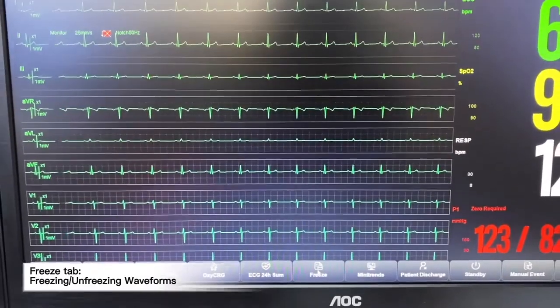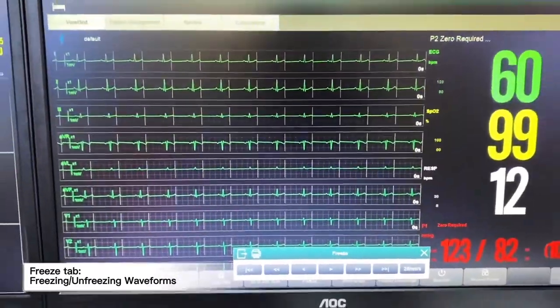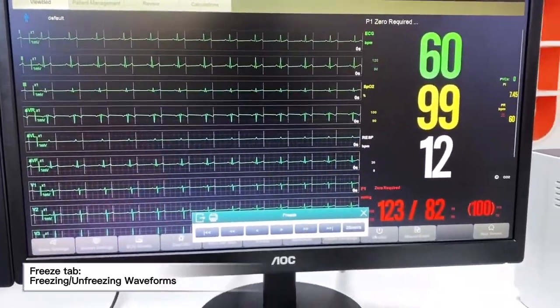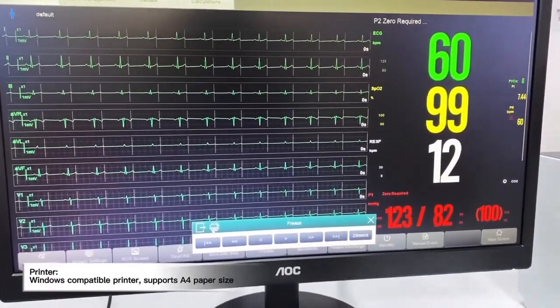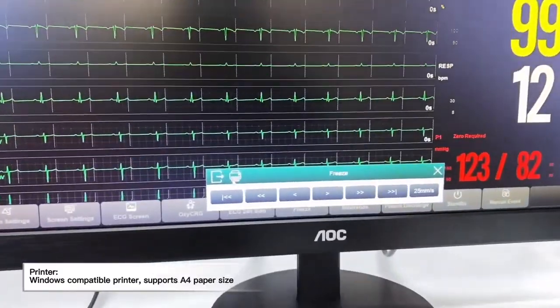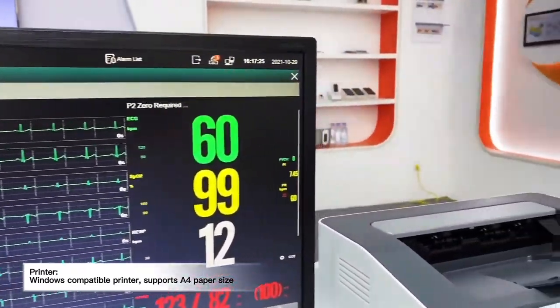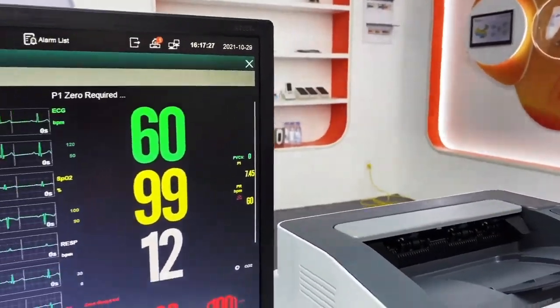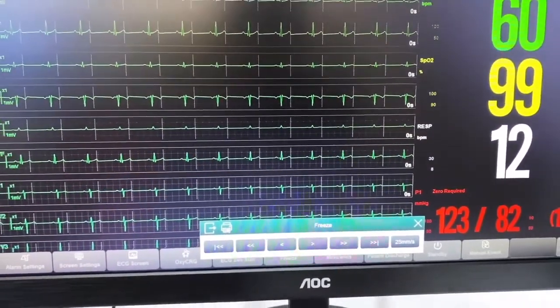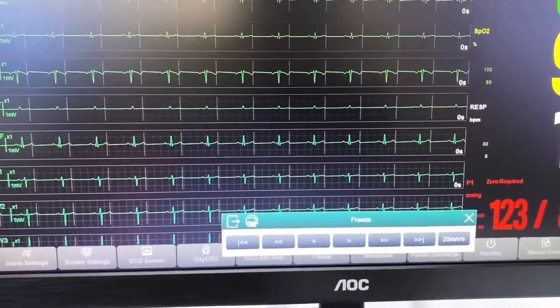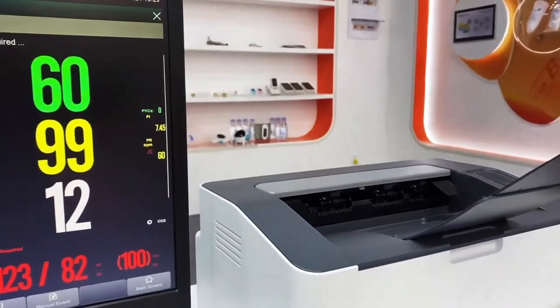We can freeze the waveform by clicking onto this icon, and once we freeze the waveform we will be able to print it out if we have a printer connected to the CMS. Once we click print, the printer will print out the trend.